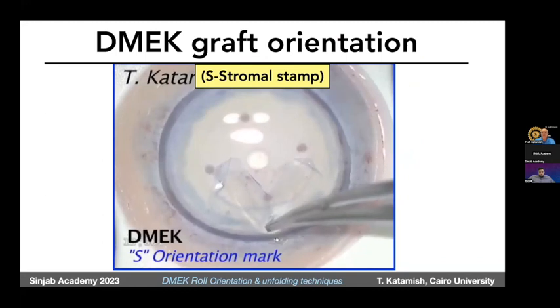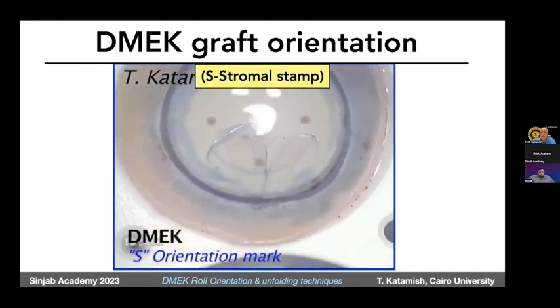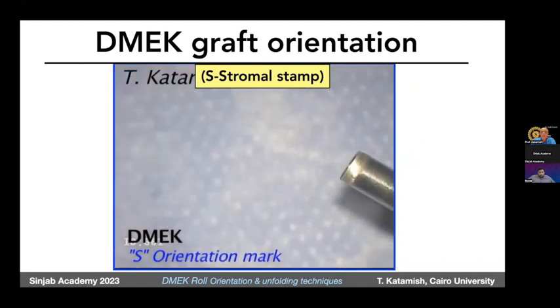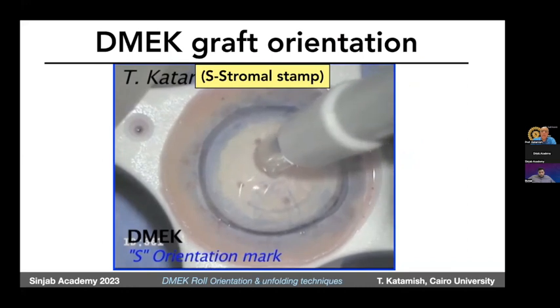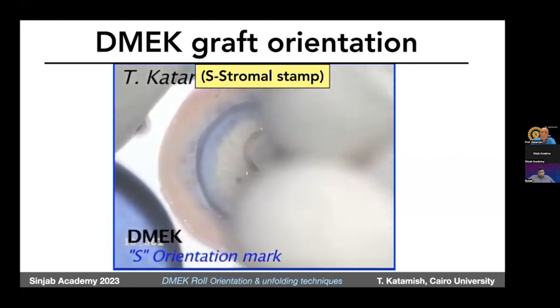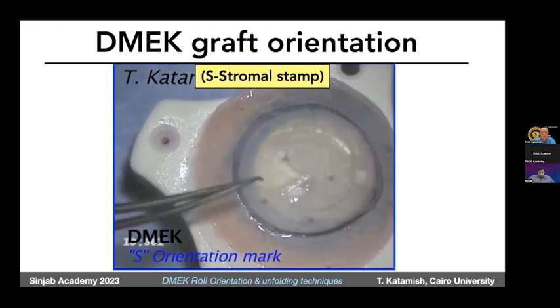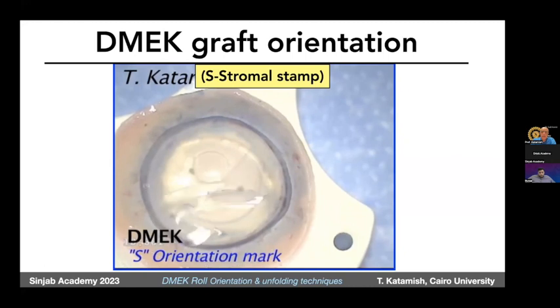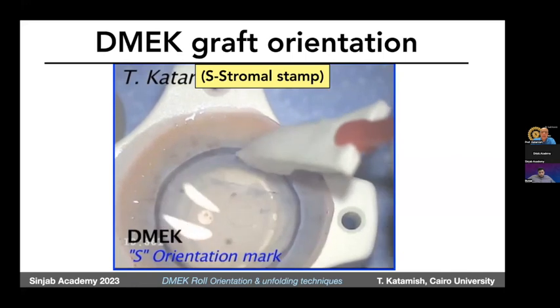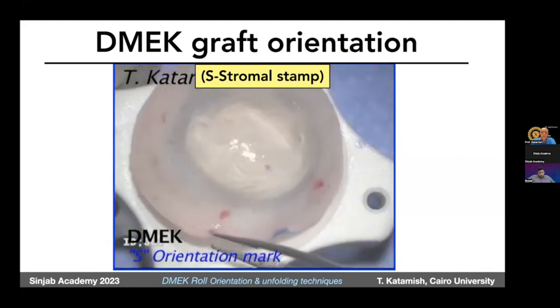During preparation, we have the DMEK tissue to the side, as you see. And then we make proper drying, and then I will use now a 3 mm skin biopsy punch to make a stromal window. You see, I make a stromal window on the stroma. Of course, I have my Descemet membrane at one side. And then when I have my stromal window, I push back again the Descemet membrane by wetting it. And by some drying technique, I will have the Descemet membrane again.